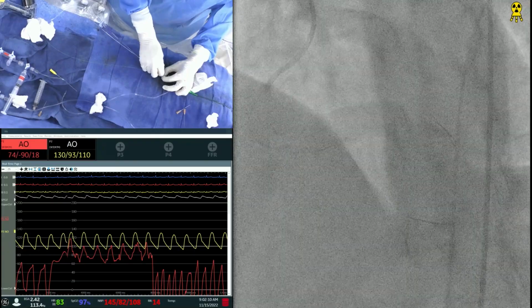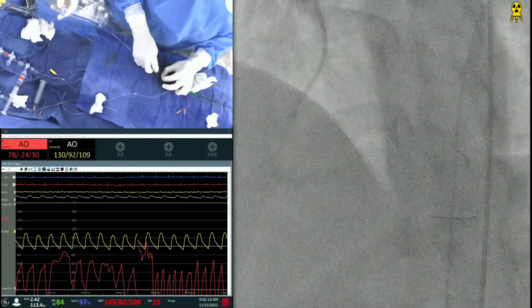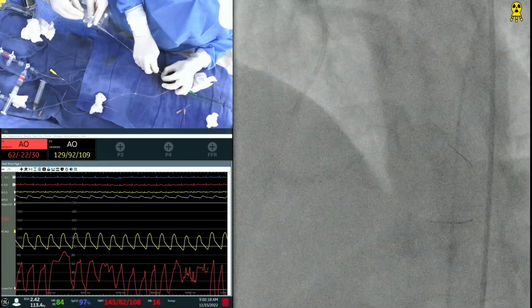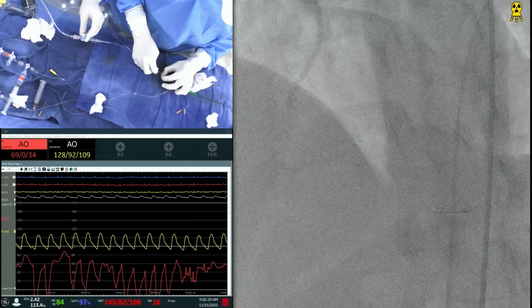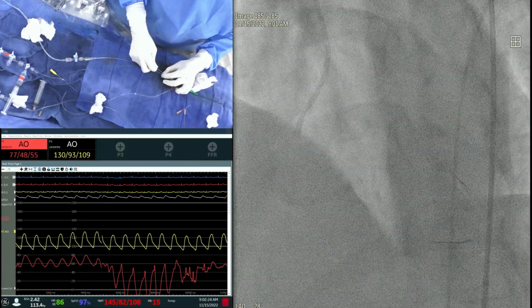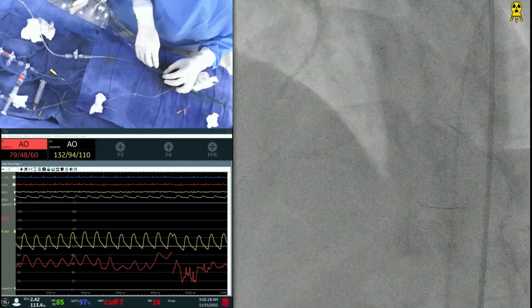No picture. Don't need it. Good. I know somebody is complimenting your result. Great, excellent result. I don't even know where the lesion was. Connect. Go negative. Let's put definition in both of them. Good. They're angiographic going up, result in a PCI. Go both of them.